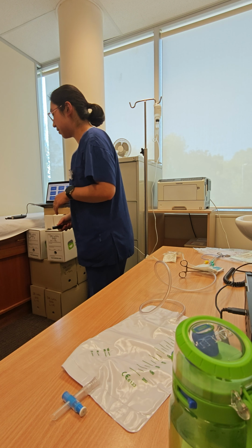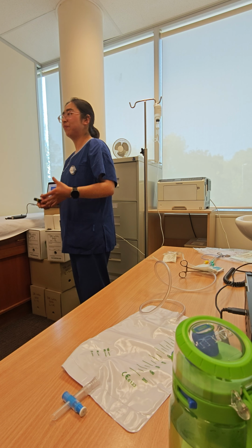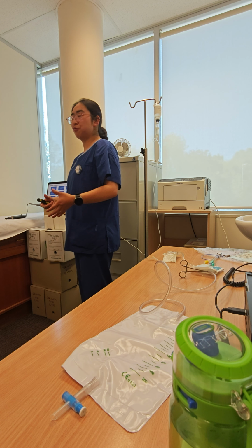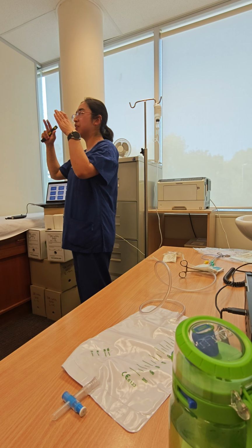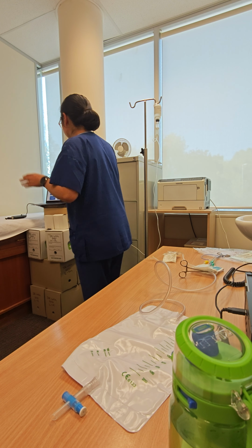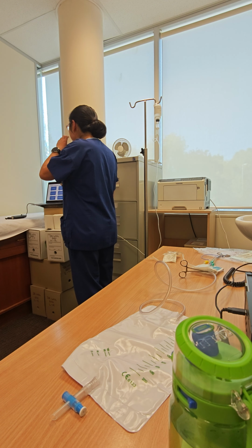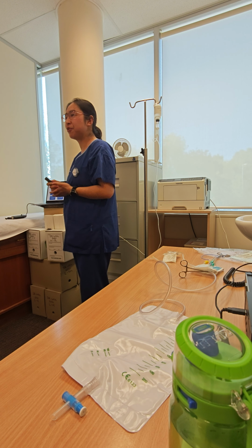What are we going to do next? So we're gonna have our prelim picture. That means just taking X-ray pictures of the pelvis without contrast. So we're gonna put the bladder in the middle, make sure the collimation is in the optimal size. Well, it's all done. Now, what are we going to do? We're gonna go see our doctors. Tell them we're ready for the procedure.